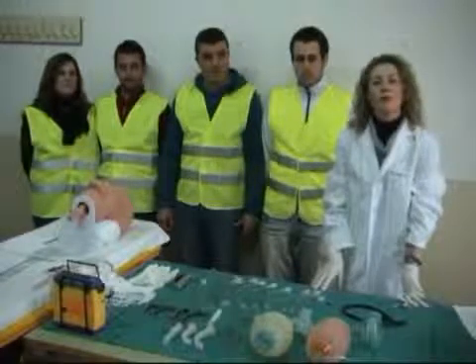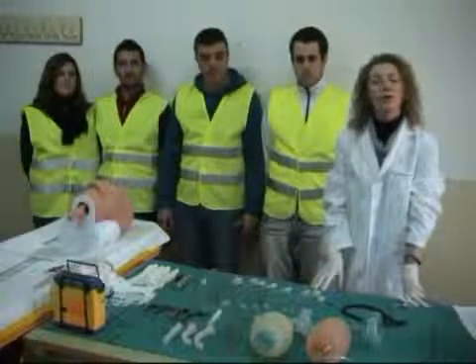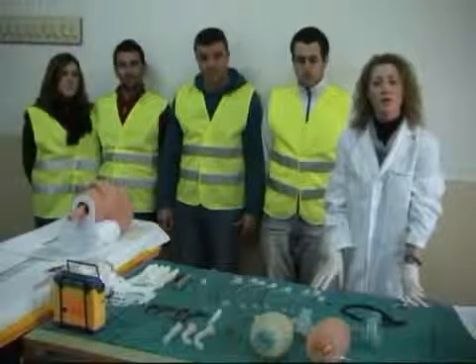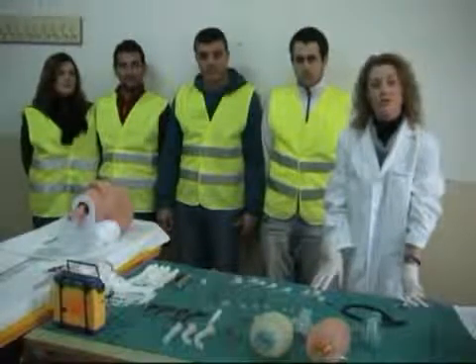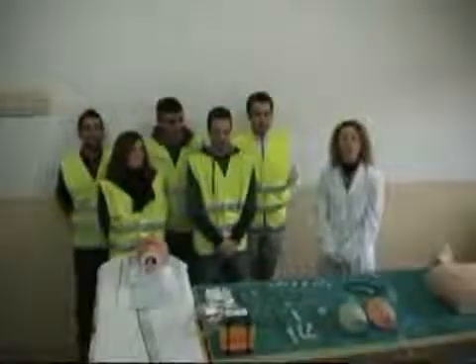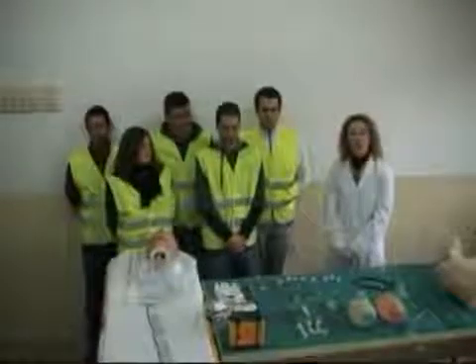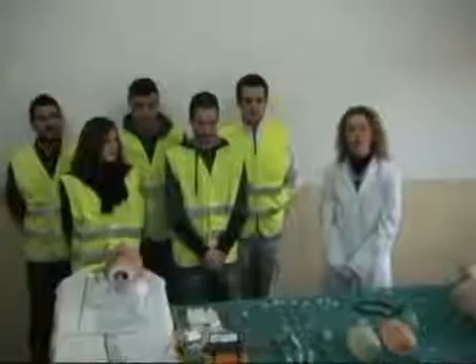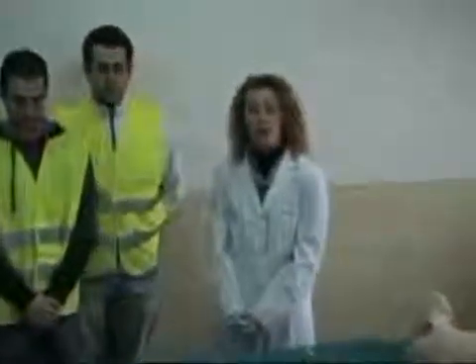Orotracheal intubation is considered a cornerstone among these procedures and is indicated in every situation in which a definitive control of the airway is needed. Generally speaking, the main role of paramedics in this procedure is to help the medical staff along the orotracheal intubation. Nevertheless, to fulfill this task properly, the students need to take into account several key points.